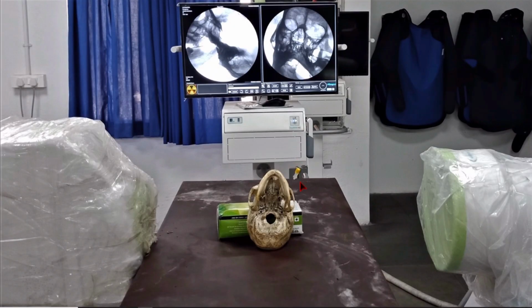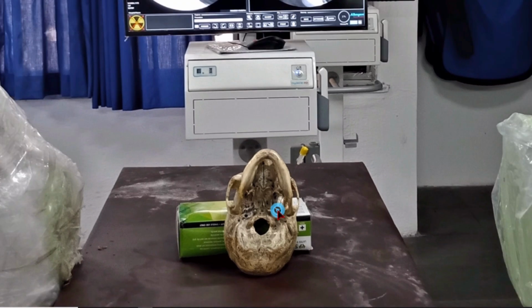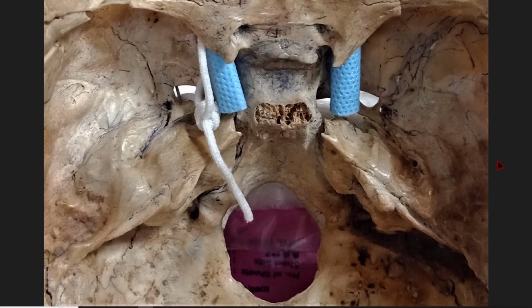Now I will show the lateral view where we'll try to superimpose all the structures on both sides, and I have kept the needle. You can see the needle is kept just outside the foramen. Needle is put just at the foramen, you have not gone inside. Then what will you see in the lateral view?